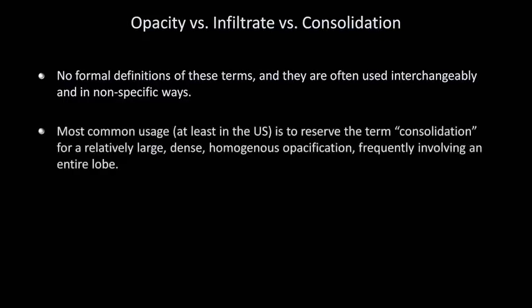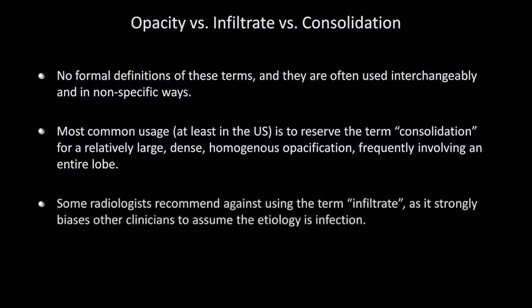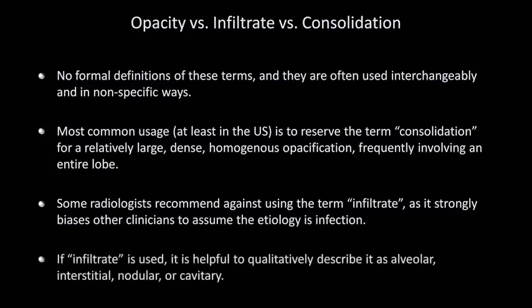In the most common usage, at least in the US, the term consolidation is reserved for a relatively large, dense, homogeneous opacification, frequently involving an entire lobe. Some radiologists recommend against using the term infiltrate altogether, as it strongly biases other clinicians to assume the etiology is infection. If the term infiltrate is used, it is helpful to qualitatively describe it as alveolar, interstitial, nodular, or cavitary.